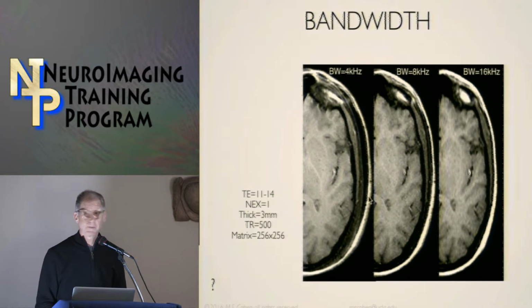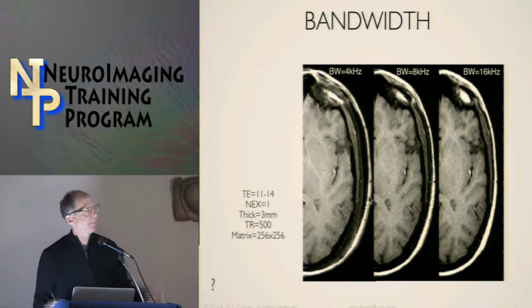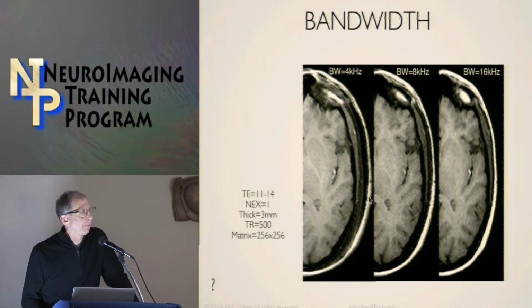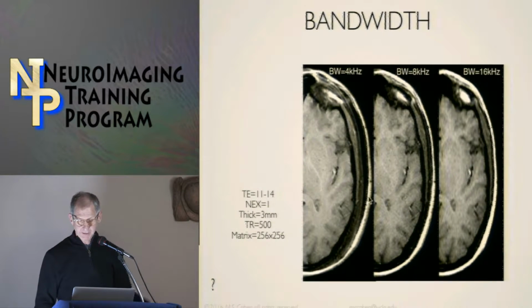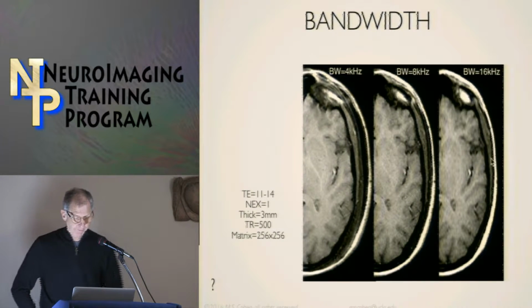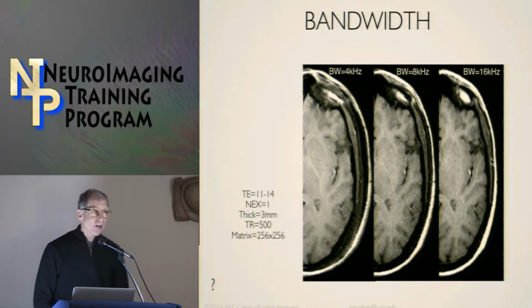Skin. Skin. So bone produces virtually no signal. Its T2 star is extremely short. Okay, and again, tell me what's different about the white strip. Yeah, so it's on the image on the left, it's moved way over from the brain compared to the image on the right. Okay, and in fact, so look at the distance between the skin and the cortical bone over here on this picture compared to the skin and the cortical bone over here on this picture, which are the same subject at the same location. Right? So that's an artifact.